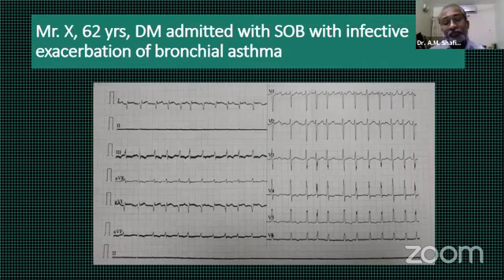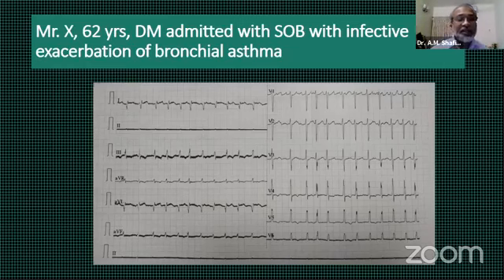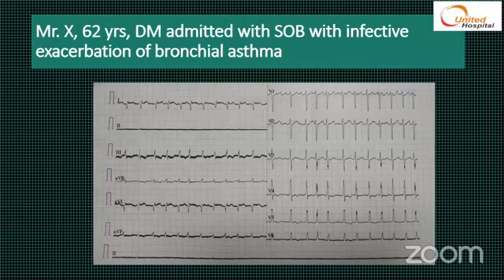And what would be the heart rate? Sir, I think there is tachycardia, fast atrial fibrillation, I think. Right, with fast ventricular rate, right? Okay, let's see the limb leads. What is the problem in the limb leads? Sir, in the limb leads, in lead 2, sir, the QRS complex is almost at the level of the baseline, and there is T inversion in lead 3 and aVR, sir.